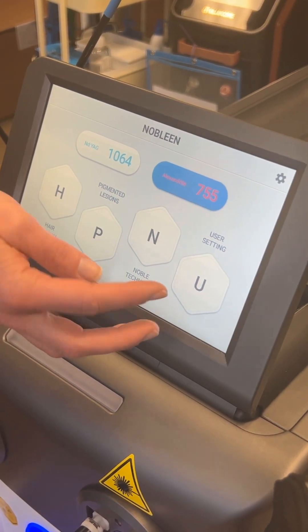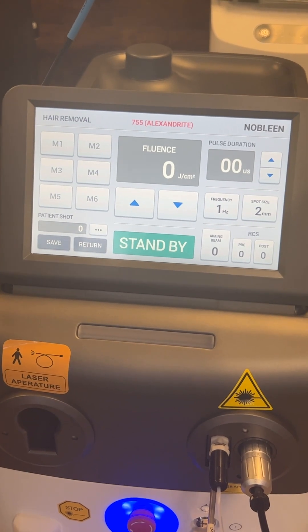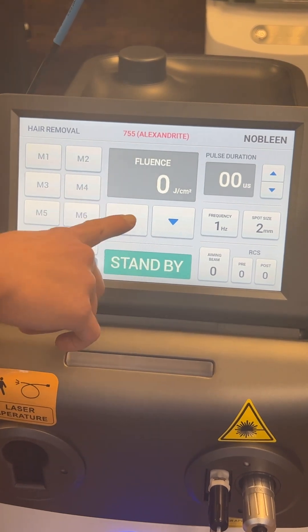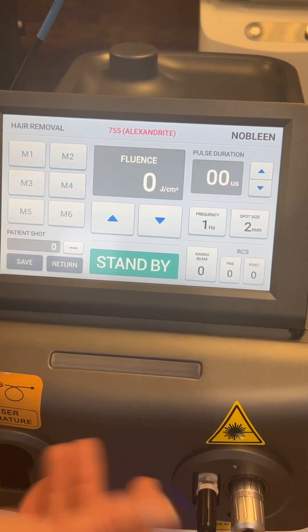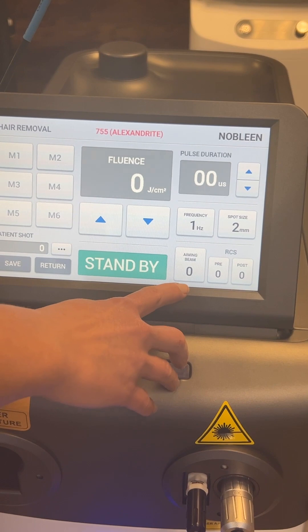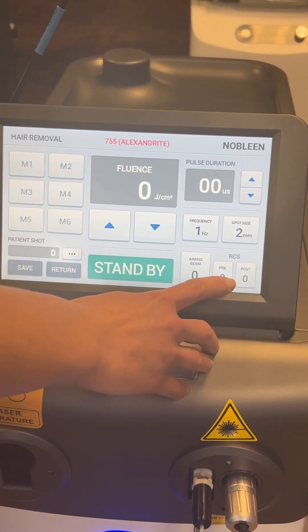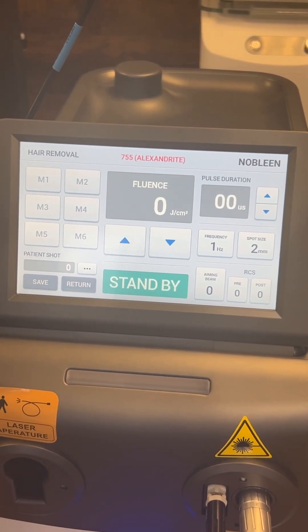Once you go in — say for instance we're going to do hair removal — this is a very nice interface. You have presets, so you can just pick one, then you can change your fluence, your pulse duration, your speed which is your Hertz. Your spot size can go all the way up to 20 millimeters. You have your aiming beam brightness, and the RCS is actually your cooling, so you can control your pre and post cooling for the treatment to make it more comfortable.